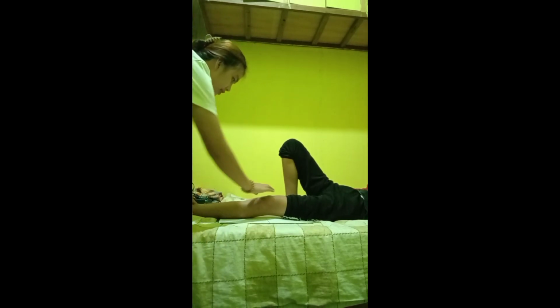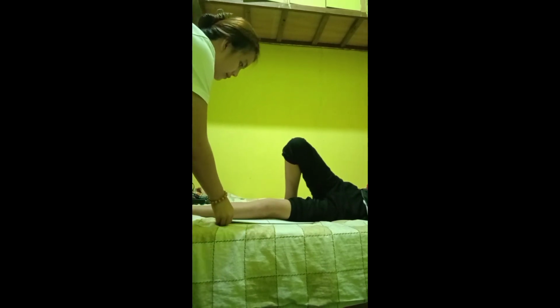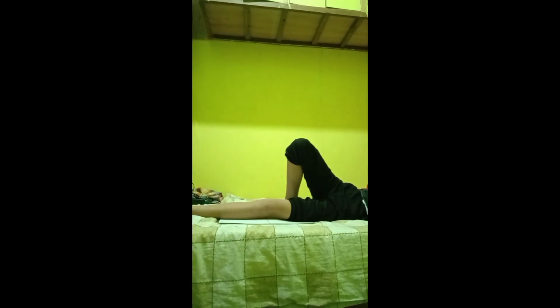Next is the lateral projection, mediolateral of my patient's knee. Instruct the patient to lie towards the affected side, and then flex the knee of the patient 20 to 30 degrees.